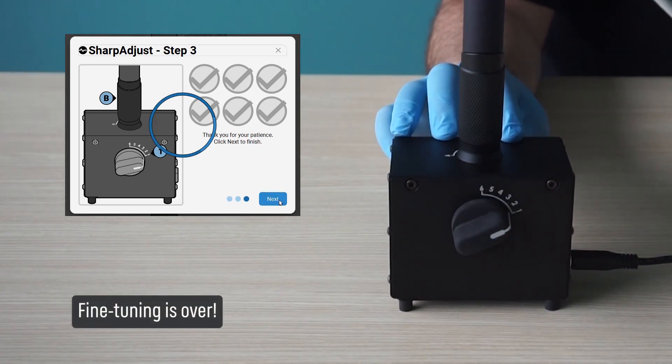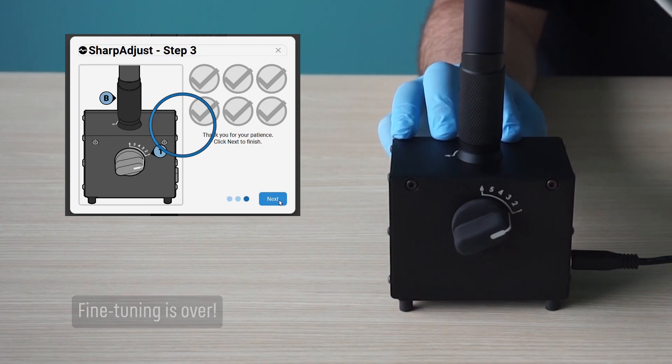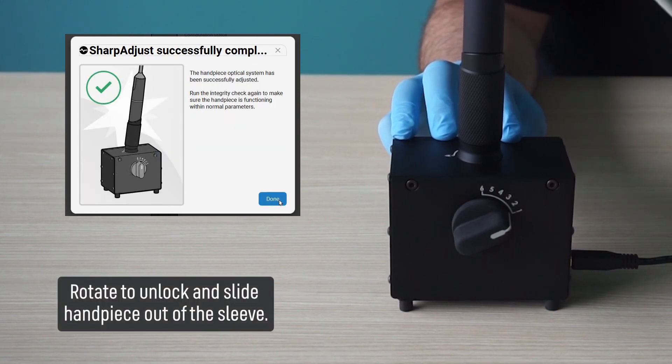Fine-tuning is over. Rotate to unlock and slide handpiece out of the sleeve.